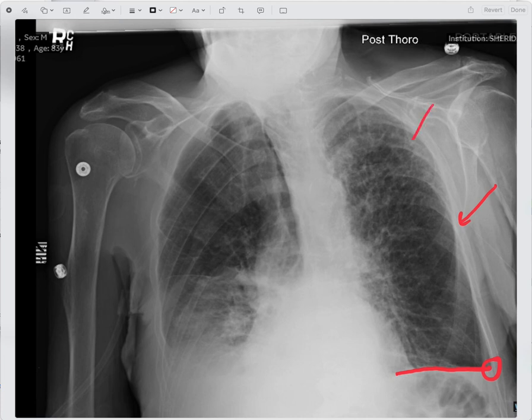You can still see these infiltrates up here on the left side more so than the right side, but there's a little bit going on here as well. But you still have this infiltrate slash pleural effusion. You can see there's some fluid down here. I put the ultrasound on him today, and obviously he still has a pleural effusion, but it's a small pleural effusion. So a lot of this is infiltrate. So he's being treated for pneumonia as well, obviously.